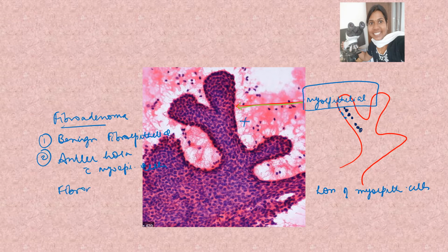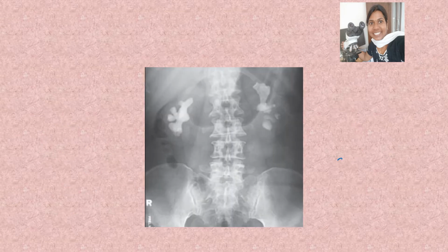You can have bare nuclei. Okay, so all these are features of fibroadenoma, which is a benign fibroepithelial lesion, right? So anything else which goes by the name Staghorn in medicine? I hope most of you will guess this. So Staghorn or antler horn pattern of cells in cytology is seen in fibroadenoma of breast.